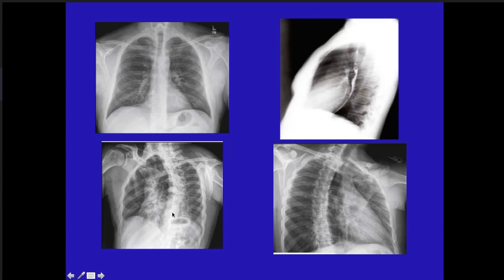And then look whether the heart is to the right of the spine or left of the spine. That's all you need to make out. And you have to look at the shape of the heart. Is it rounded or is it oval? These are the three points. So this is the LAO view and that's the RAO view.